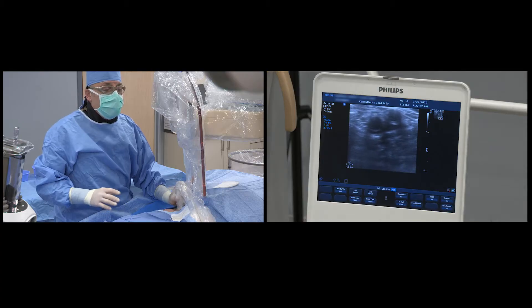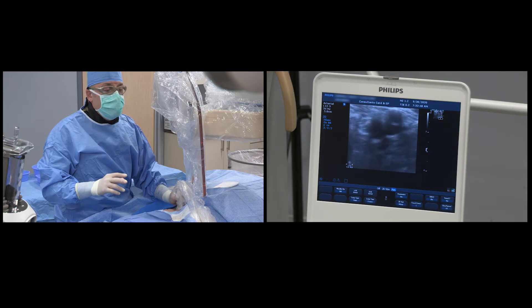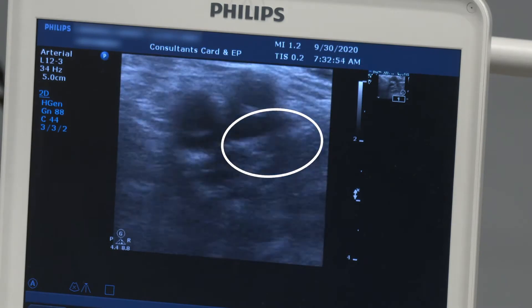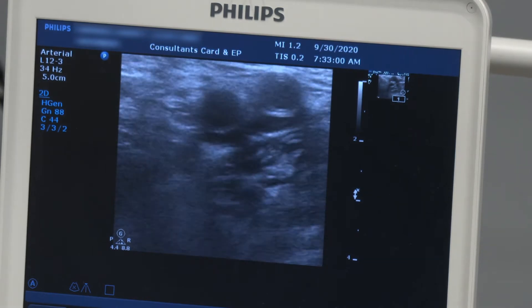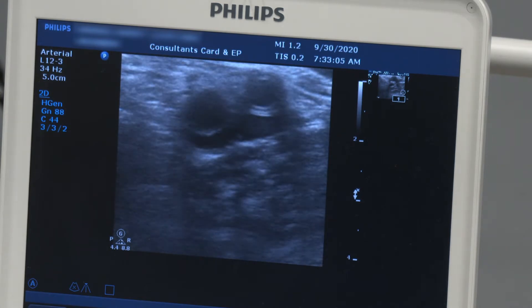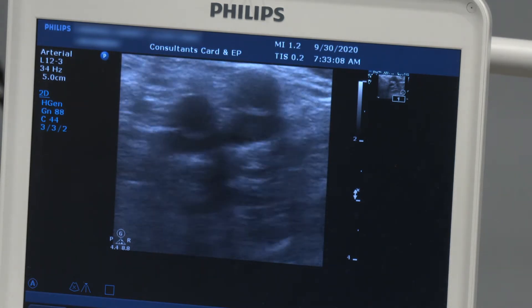When I start identifying the anatomy, I always begin by looking at where the vein is — it's usually compressible, as you see here. Then I identify the circle around seven, which is the profunda — the profunda femoris. And the circle on the top is the superficial femoral artery.